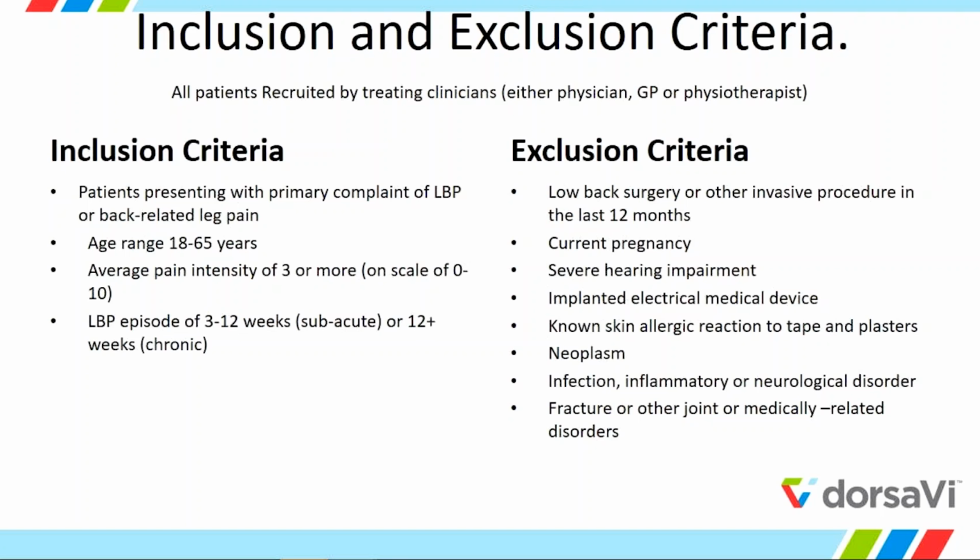Now, the nice thing about this, for those of you who are in regular clinical outpatient practice, is that it looks like your regular patient population. So it's not some group that we wouldn't normally see. Obviously, they excluded people who'd had surgery, pregnant, all those other things that we would normally exclude for.